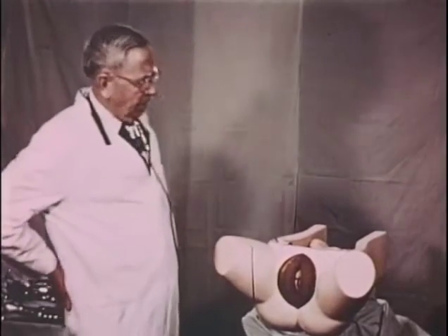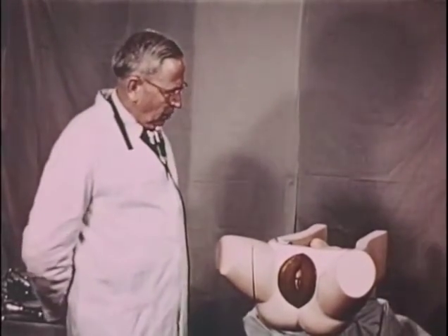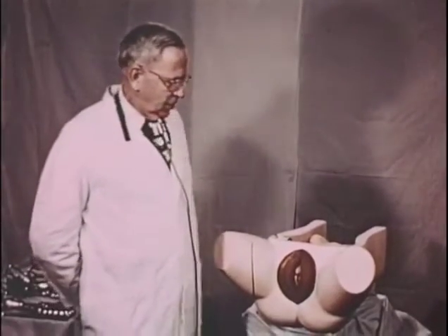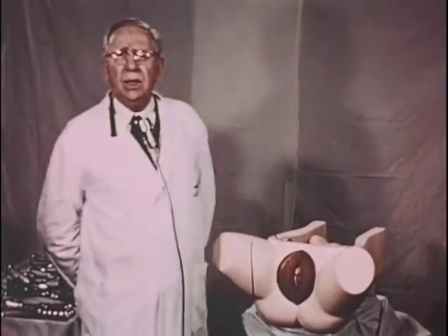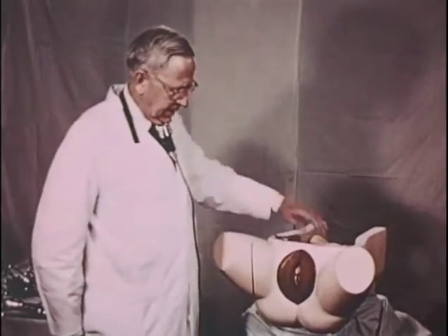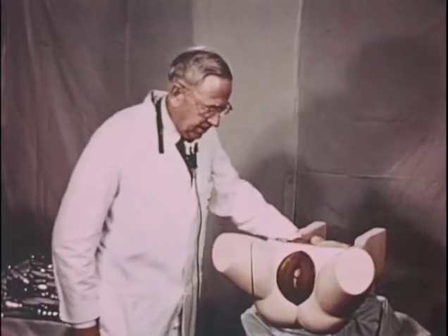We'll now take up the application of the classical forceps to a head in low or low mid station. It's assumed that the 5 prerequisites are fulfilled. And we know that the head is engaged because it is at low or low mid station. That means that the presenting part is at least within a finger's breadth of the perineum, and that the hollow of the sacrum is entirely filled.